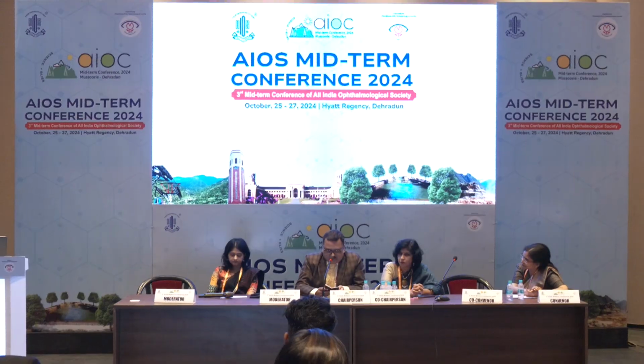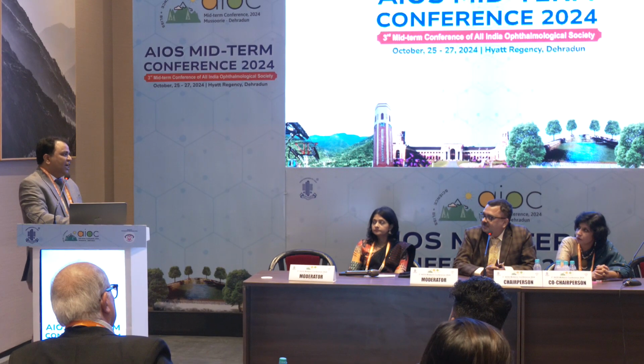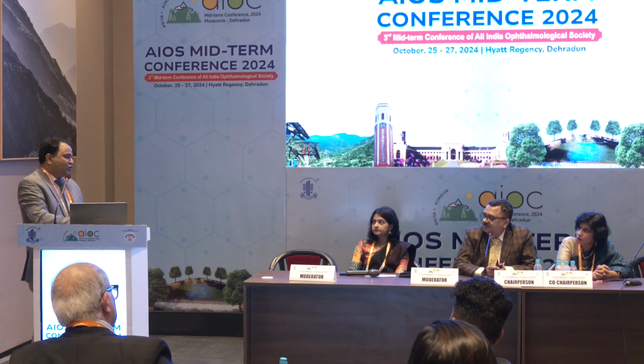Nice presentation. Thank you, sir. What is the efficacy of the gonio scrubber? The gonio scrubber is still under trial. It is very helpful in certain types of glaucomas, especially in pigmentary glaucoma and steroid-induced glaucoma. So I can't comment on it right now.